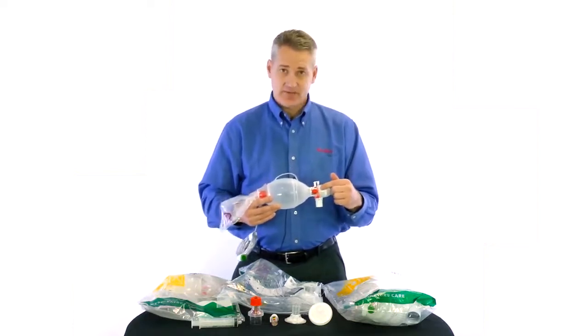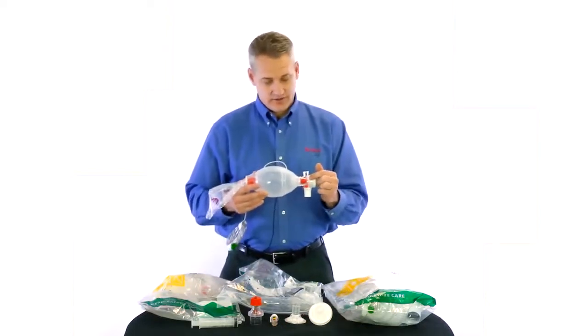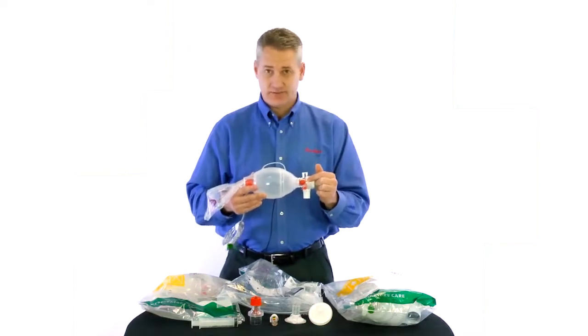Another feature that is unique to the Ambu bags, just like on our adults, is our single shutter membrane.